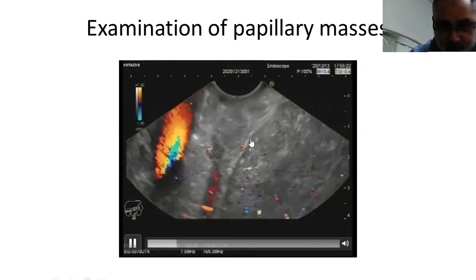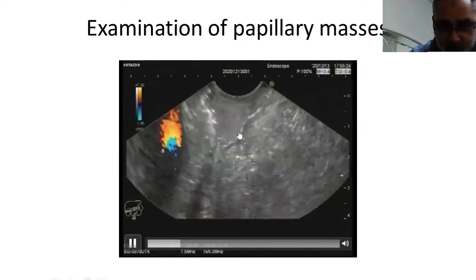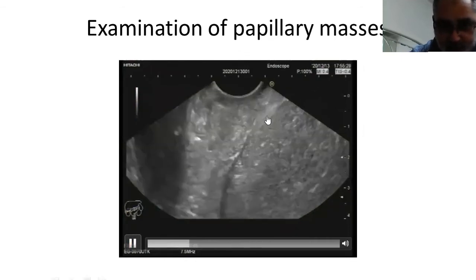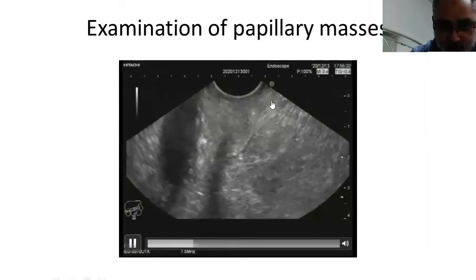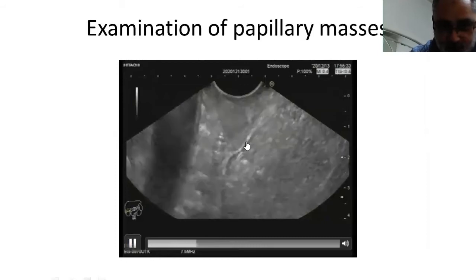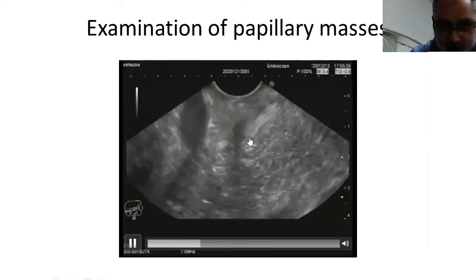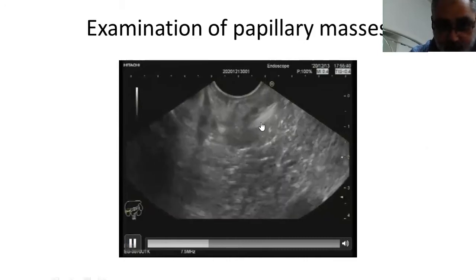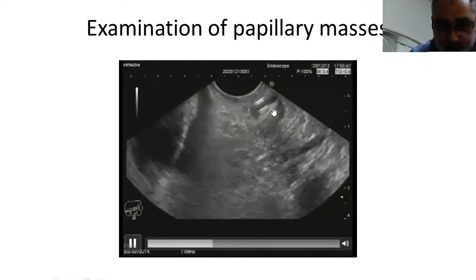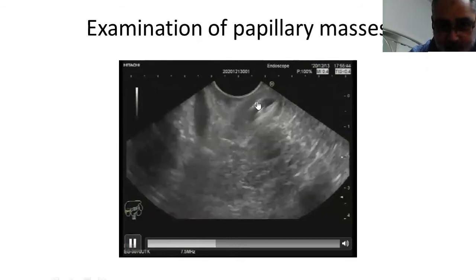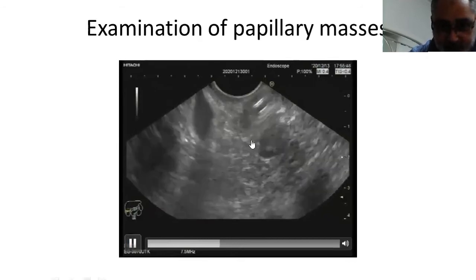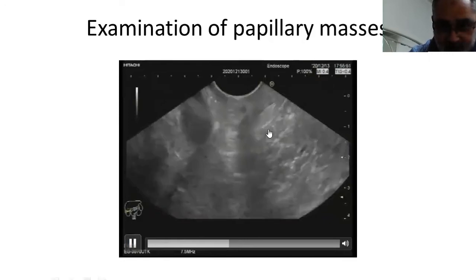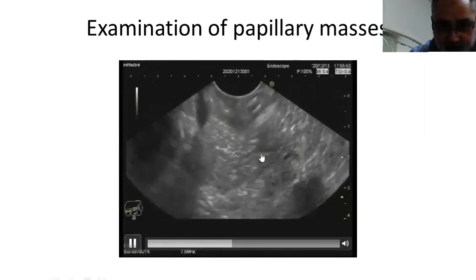Gentle minimal clockwise rotation will visualize the papilla while floating inside the lumen of the second part of the duodenum, while gradual counterclockwise rotation — this is the muscularis propria — will visualize very nicely the muscularis propria, and this is a small papillary mass. More counterclockwise rotation will visualize the common bile duct with a plastic stent inside and the pancreatic duct. This is a double duct sign and part of the region of the pancreatic head.